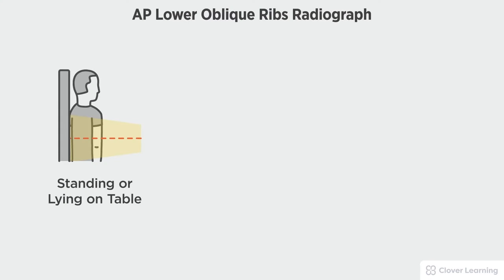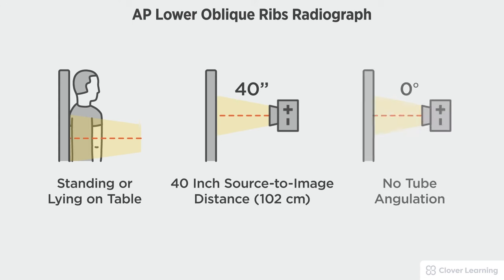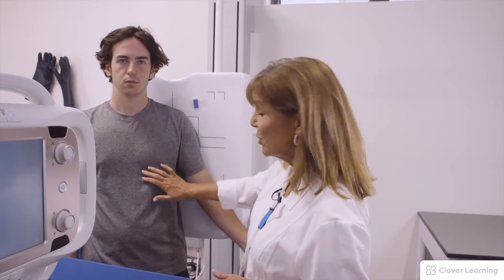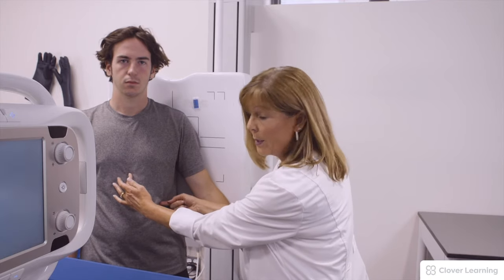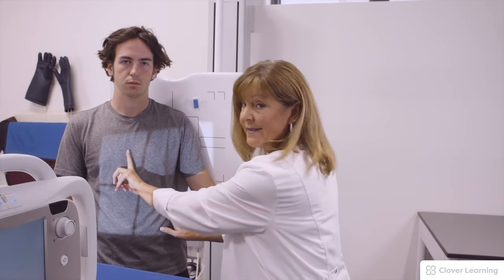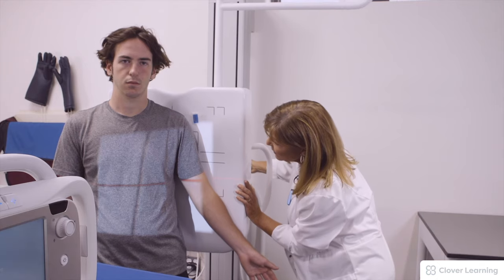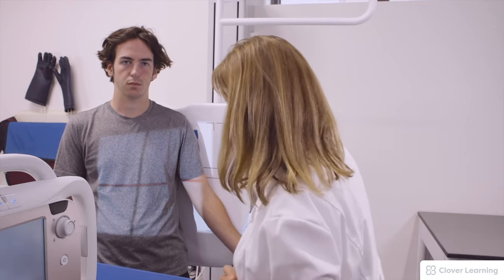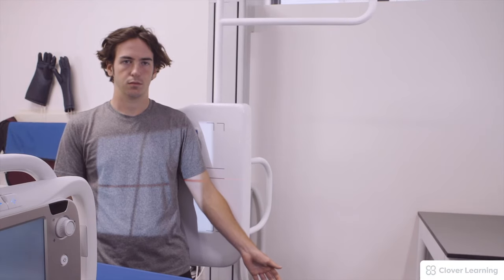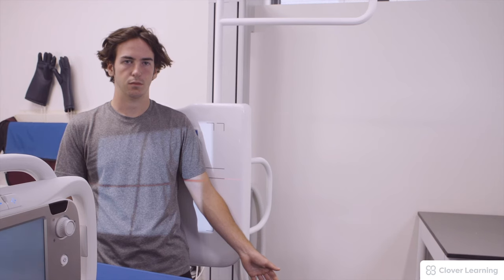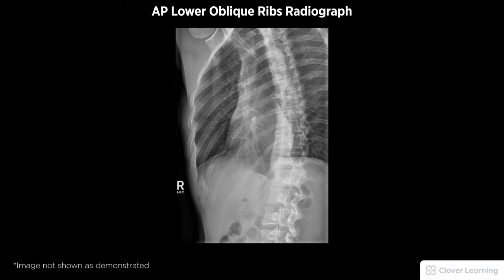In this view we will be demonstrating the AP lower oblique ribs. The AP lower oblique ribs should be performed with the patient standing at the upright bucky or lying on a table with a 40-inch source to image distance and no tube angulation. The patient remains in position and we center halfway between the xiphoid and the lower rib, mid-sagittal plane to the lateral side of the body, to demonstrate the ribs beneath the diaphragm. This is done on expiration — the patient takes a deep breath, blows all the way out, holds, and the exposure is made.